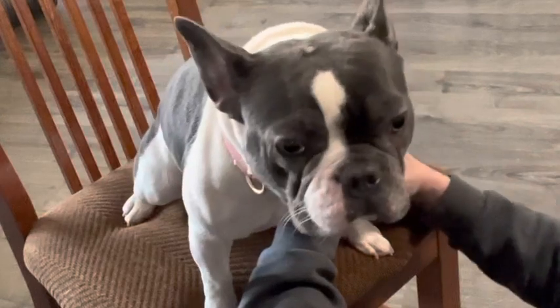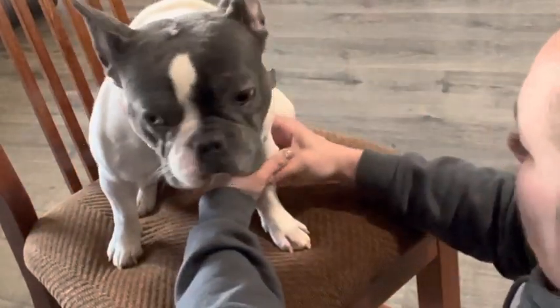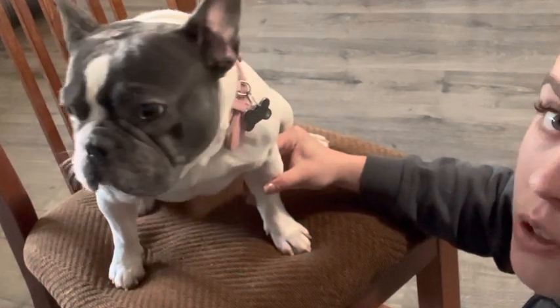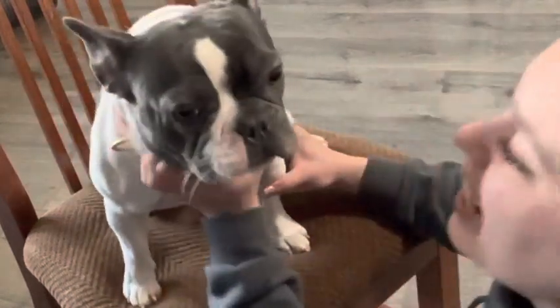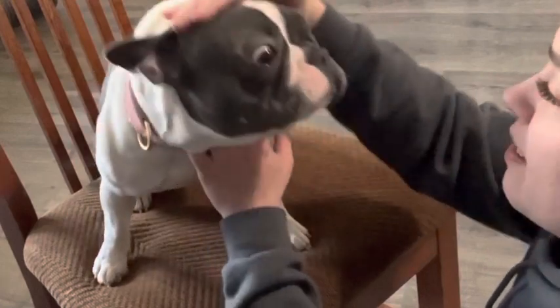And then you just pinch off that spot so it doesn't drip — I got a little bit on me, but it's not too bad. And then I'll get some baby wipes and just wipe her off, or a wet paper towel. Good job, Dee. Good job, you did so good. And that's how you do a blood draw. Super easy.